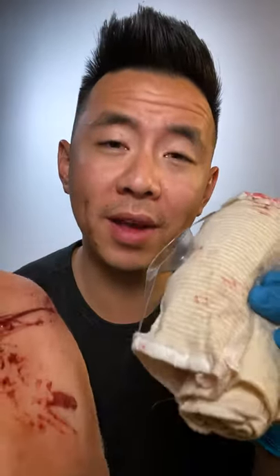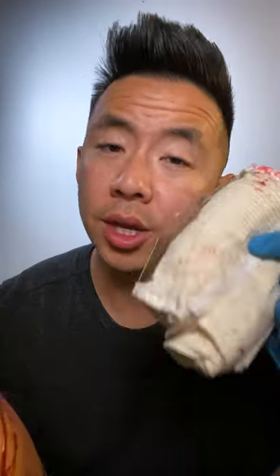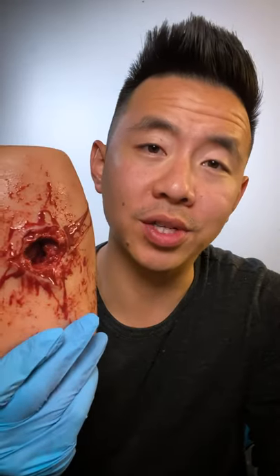Today we're talking about pressure dressings and one of my favorite bulky dressings, the Olase Bandage. It uses this little plastic cup to put direct pressure right on the wound. You can reach for a pressure dressing like this if it's not a big bleed and it stops with direct pressure.